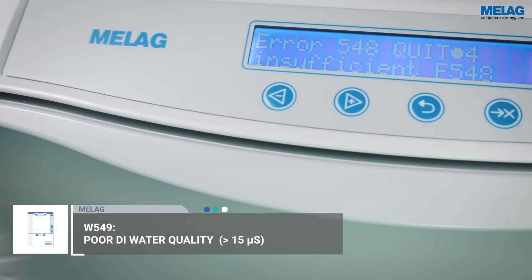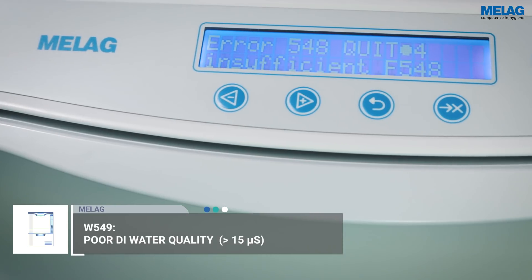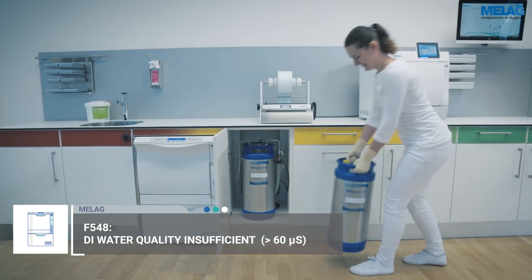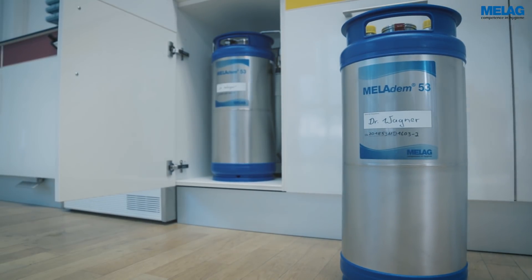The MELAtherm 10 and modern MELAG steam sterilizers automatically test the conductivity of the demineralized water and issue a warning if the water quality is too low.